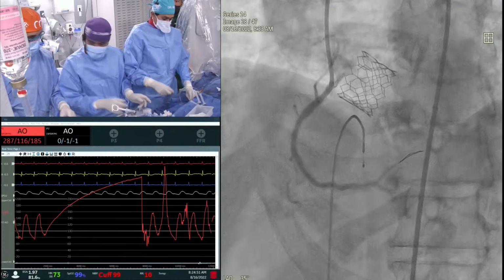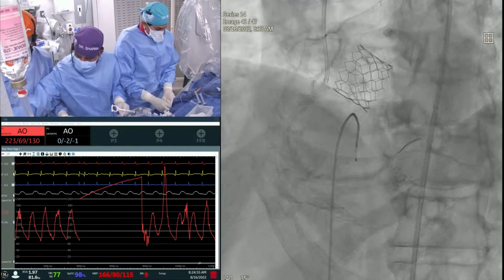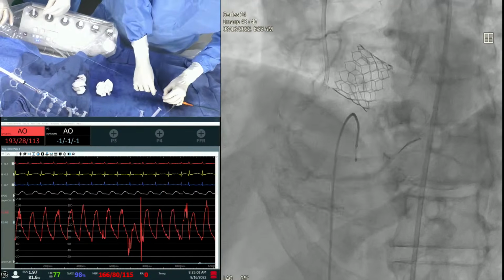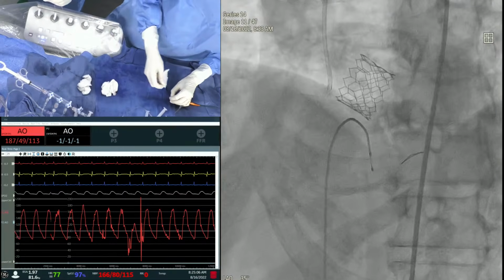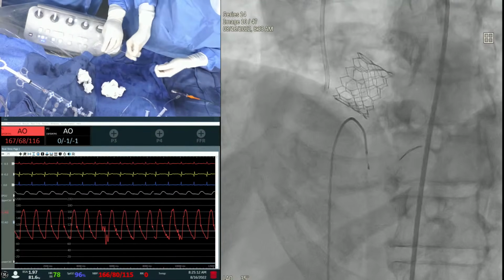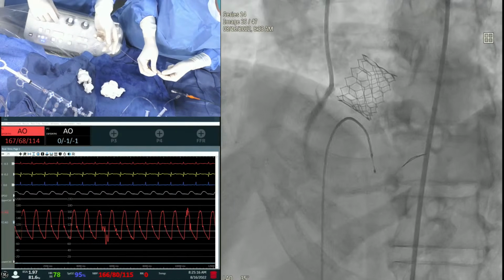4.5 by 15 Zions. What is the name of this? New different name or same? Okay. Show me the box. Put the hemo by the side of the angio. Yeah, so it's the same Zions SkyPoint 4.5 by 15. Compared to Synergy, for ostial and large vessels it is Megatron, the name here is just the Zions.